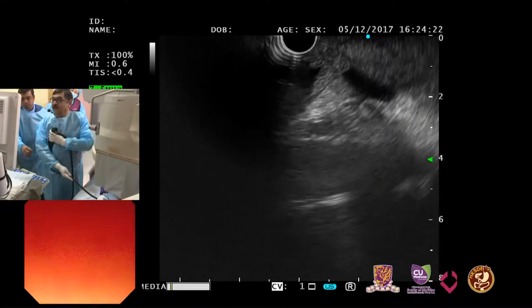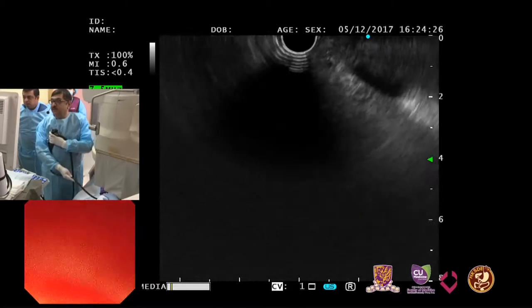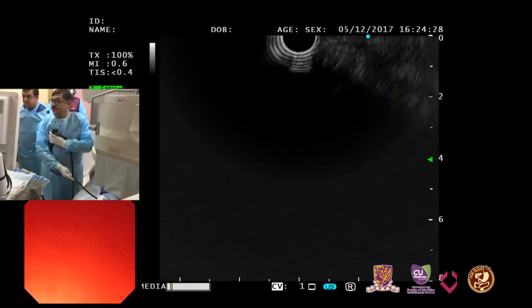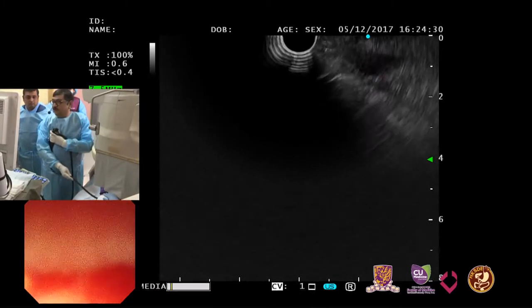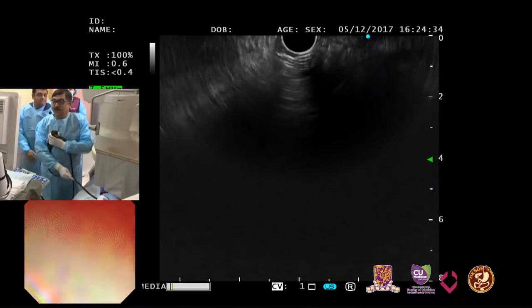Stop the water. Okay. I don't think we should do any therapy here. Maybe we should do a side-viewing scopy just to check the papilla, which we can do later on. Sure, no hurry in doing it. So any comments from the audience?